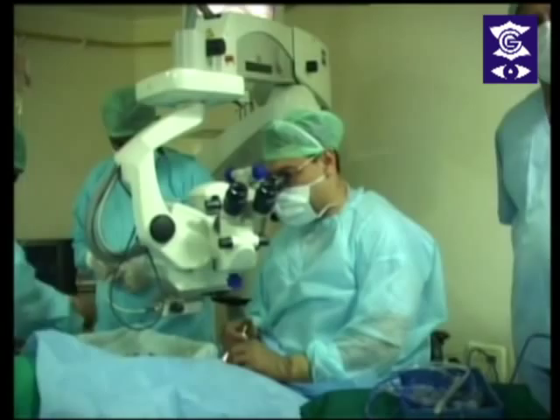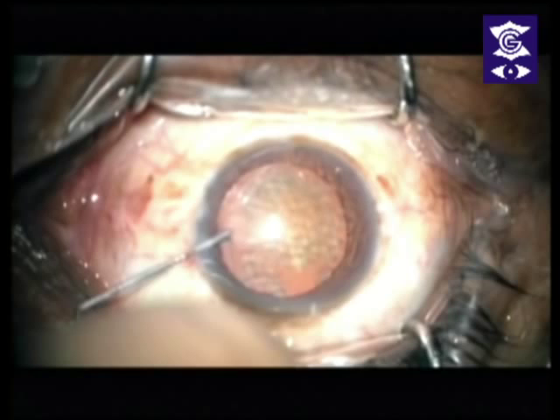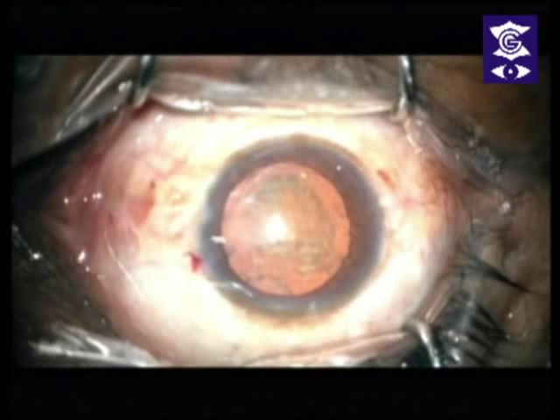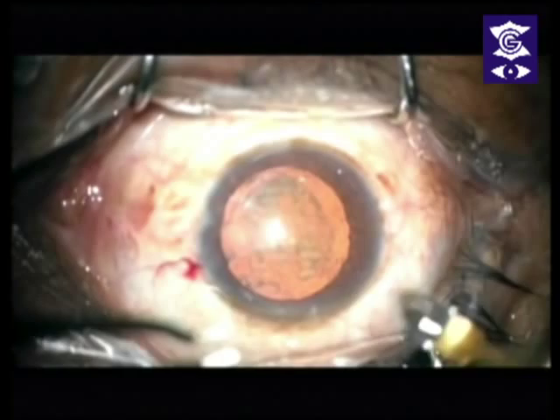The trick to doing these cases under topical is to start Parakene 10 minutes before you put the patient on the table, and not just put one or two eye drops when the time comes to operate. What happens is that the conjunctiva and cornea and everything gets adequately anesthetized.